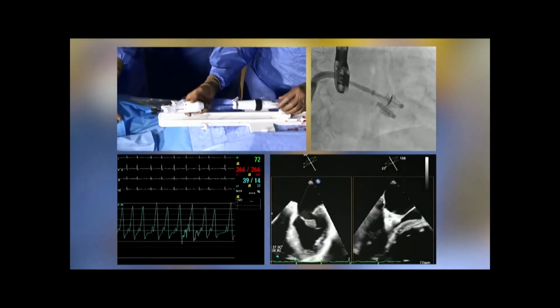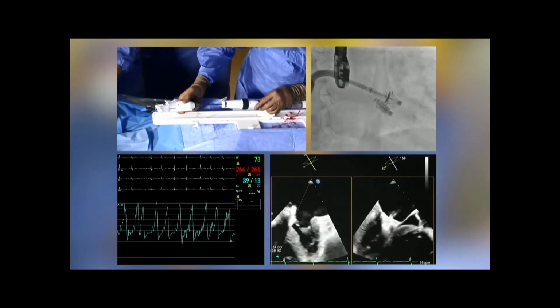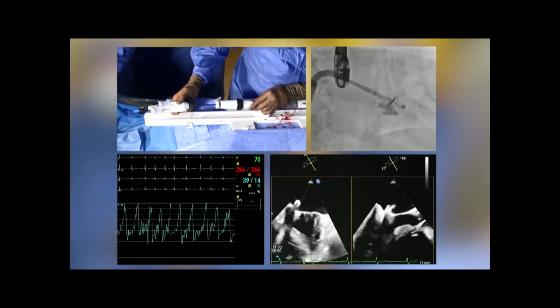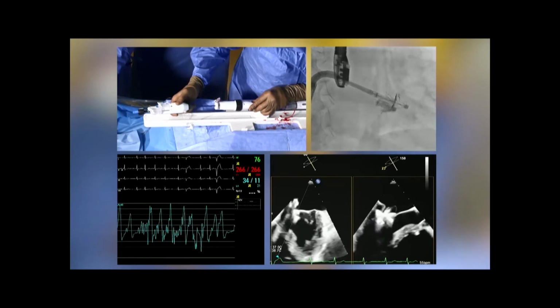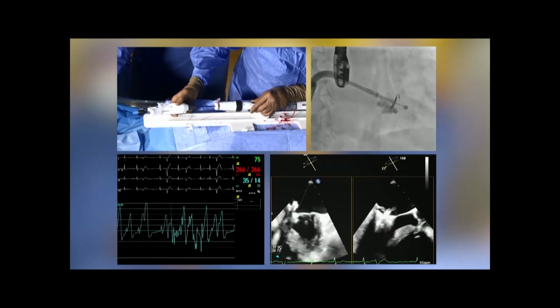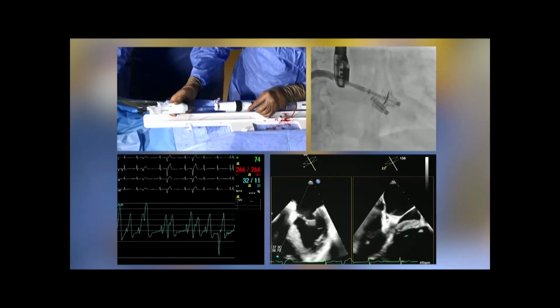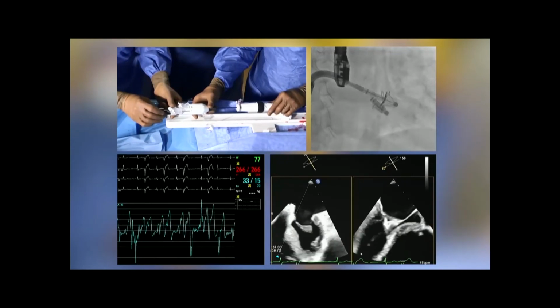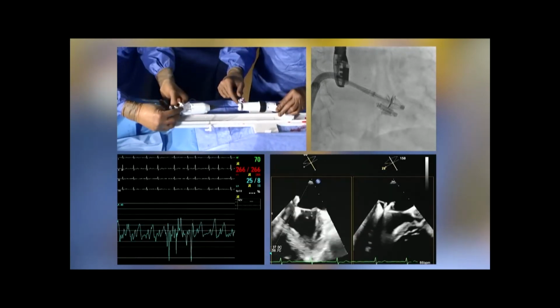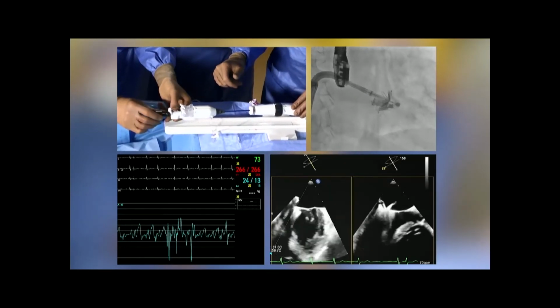Explain. So here you see that posterior we are above. I go in now gently because we are in proximity to the first, and we have one already down. Now you see the device rolling. So either we wait until it sorts itself, which it did. I think now it's not rolling anymore. It's curling because it's so long. We bring it down. All right. And then I think we are fine to close it.